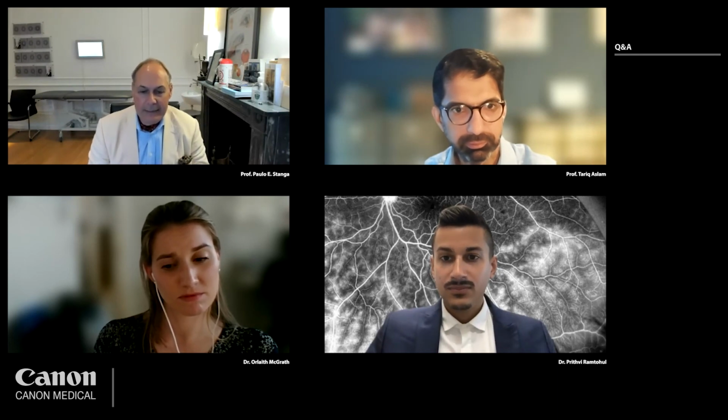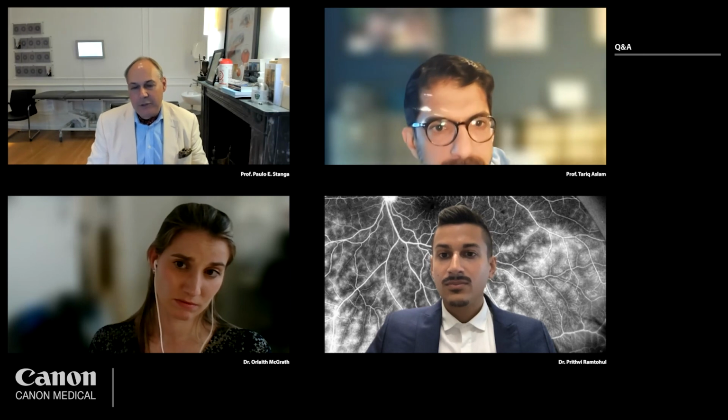I do. I think, well, acute PVD, we see a lot of patients. You want to be objective. We see a lot of patients that were seen elsewhere and they were told that they have a PVD. And I believe in indirect, but I'm a retinal surgeon, I believe in indirect ophthalmoscopy with 360-degree scleral indentation.